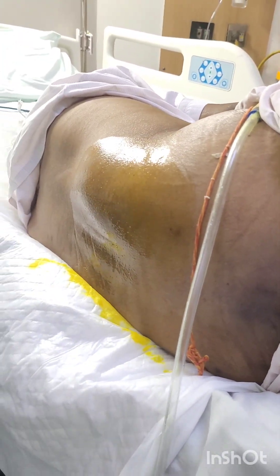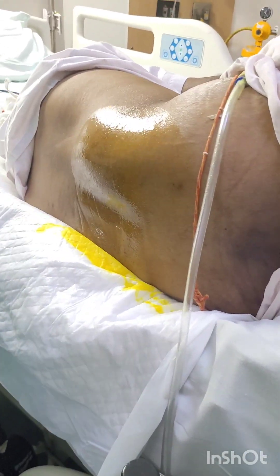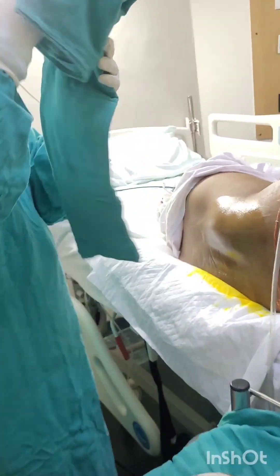Hi everyone, Dr. Josana here. I am doing a lumbar puncture today. Put the patient in the right or left lateral position, and the knee should be touching the chest. At the level of the highest point of the iliac crest, just come down.